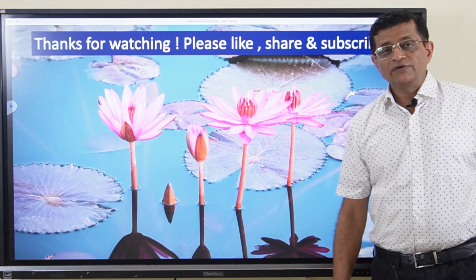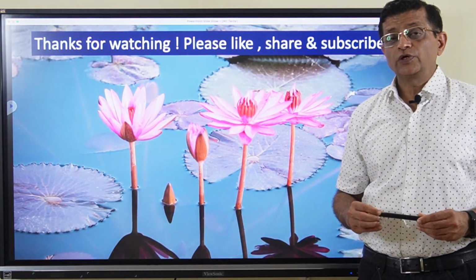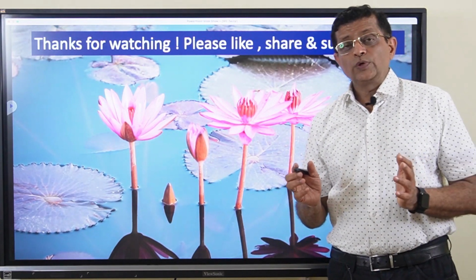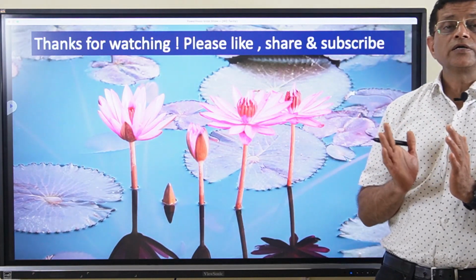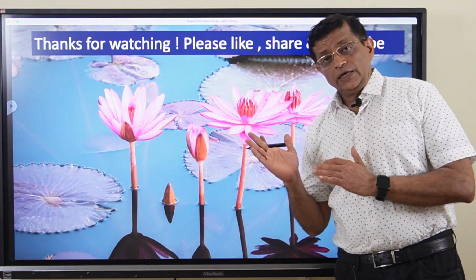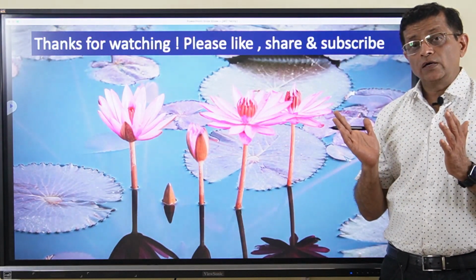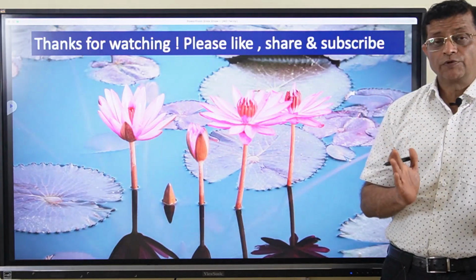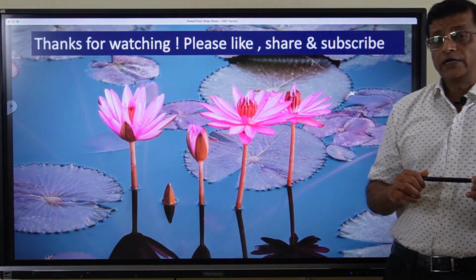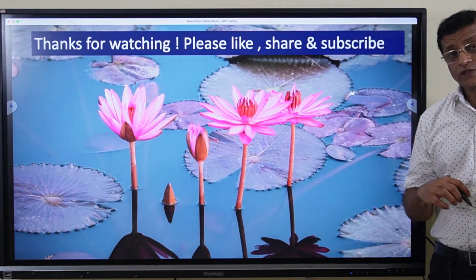So here we have seen how to approach a patient with wide complex tachycardia, and how you will come to know whether this is a ventricular tachycardia or a supraventricular tachycardia. In the next lecture we will see various algorithms to diagnose ventricular tachycardia from supraventricular tachycardia in a wide complex tachycardia. So kindly see this lecture properly so that you can understand the next one.